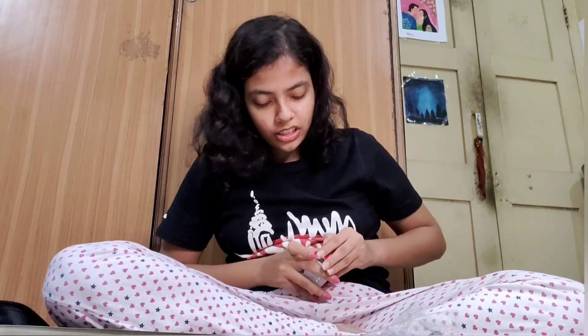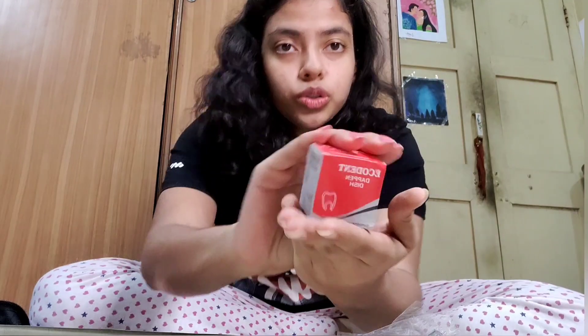We have something called the Dappen Dish. It's used for some holding purposes — I'm pretty sure.